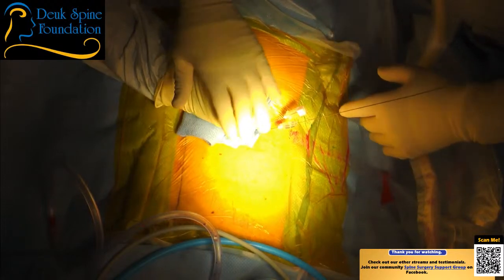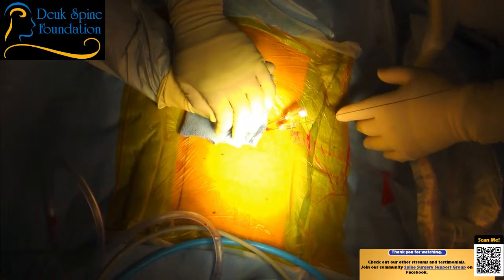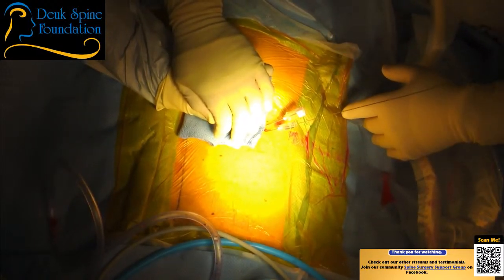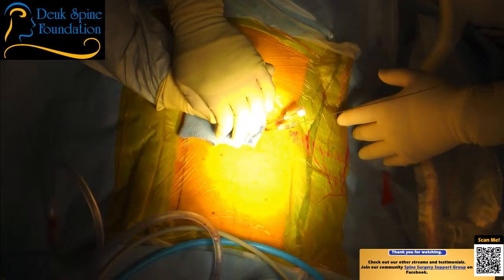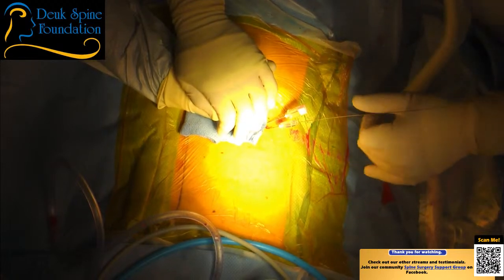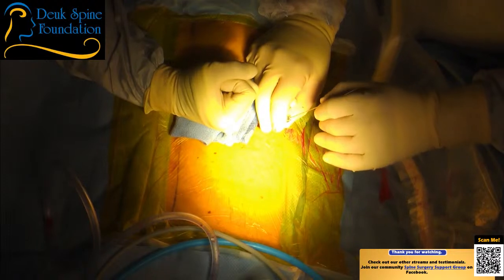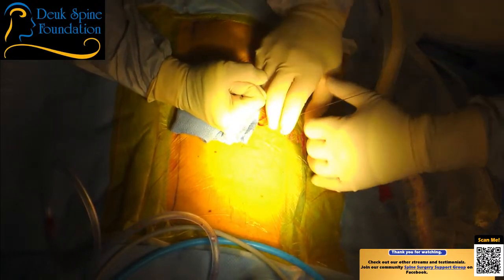So which is harder to get rid of, steel or a bone spur? Bone spurs are much easier than steel. So yeah, these lasers cut through bone spurs. There used to be rumors going around out there, misinformation as there's so much, that the laser can't cut through bone spurs, but it can. Do it all the time. I don't know if that answered your question or if it's sprung up a new question, but if it did, let me know. I'll be happy to keep trying to answer your questions for you.